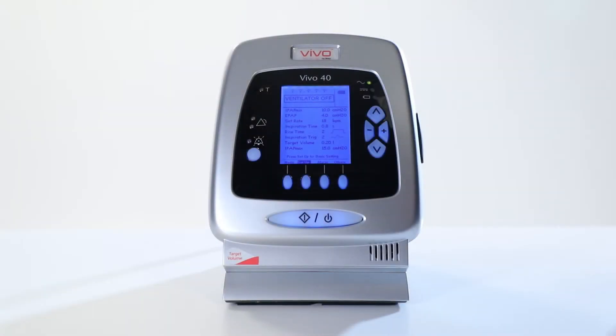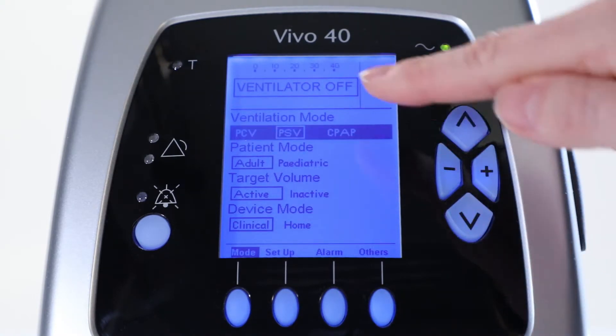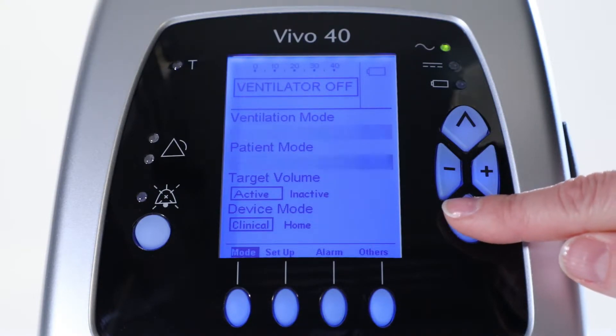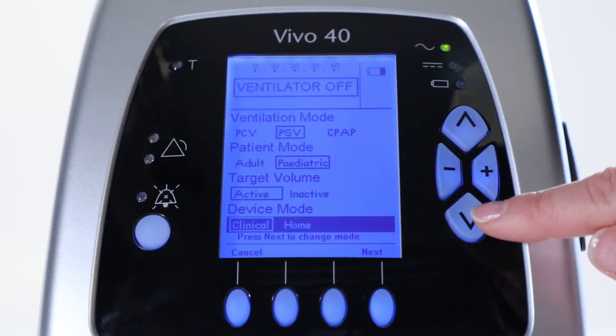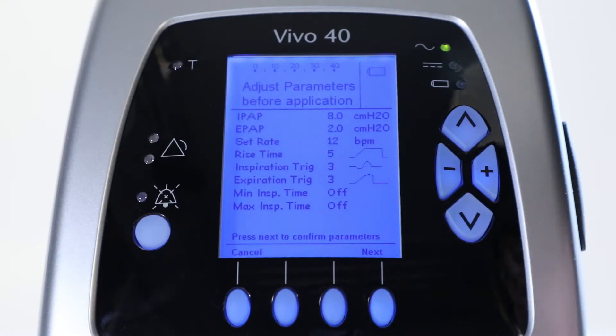Let's start by going to the mode section of the Vivo40 and select pressure support as the ventilation mode. PSV has been selected. Then, select the Pediatric Patient mode and activate the target volume. Stay in Clinical mode. Press Next to change the mode and set the parameters.